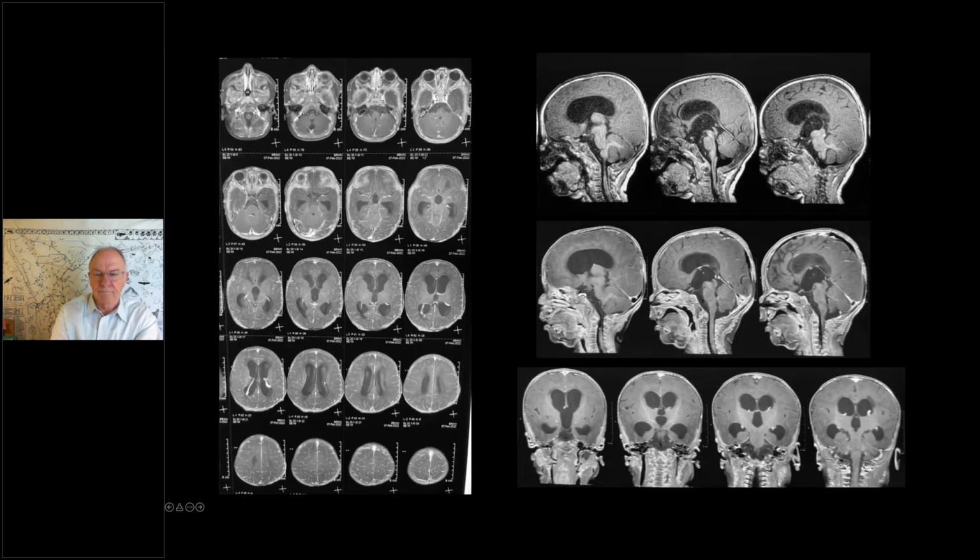So we have the contrast MR done, and on the contrast, again, no focal abnormalities. I think it was commented as leptomeningeal enhancement, but I think these changes are normal vascular enhancement of the normal vessels in the sulci. No enhancement in the basal cisterns. No ventriculitis or evidence of ventriculitis on imaging. On the sagittal images, you can appreciate that there is focal narrowing at the inferior aspect of the aqueduct. So this is the likely cause of the hydrocephalus.